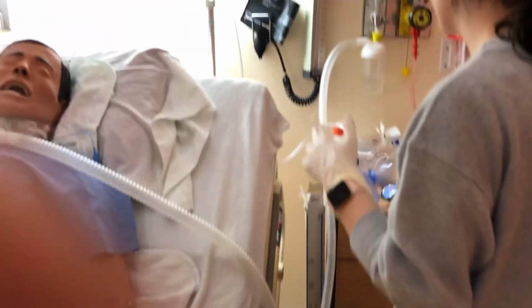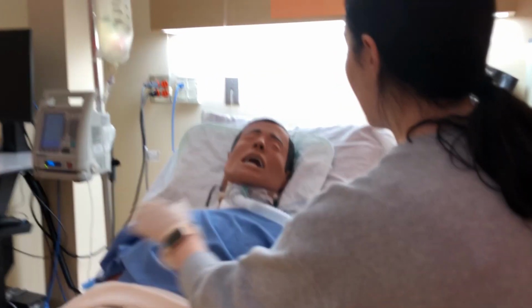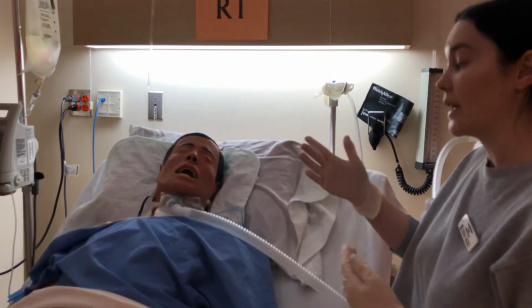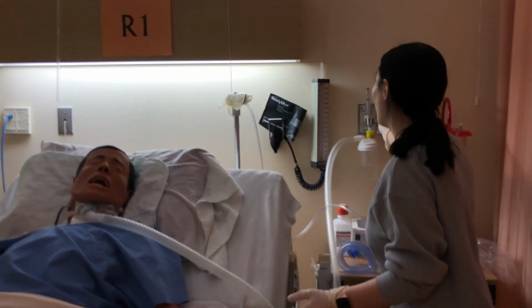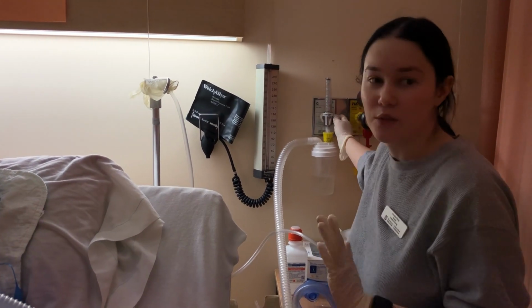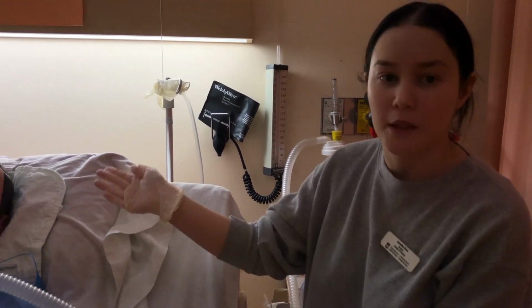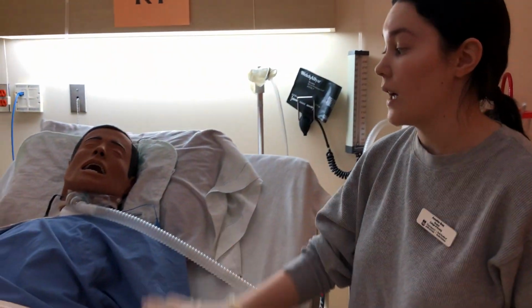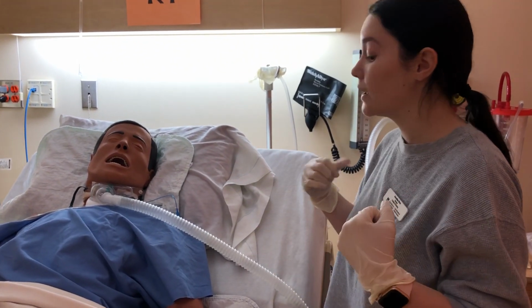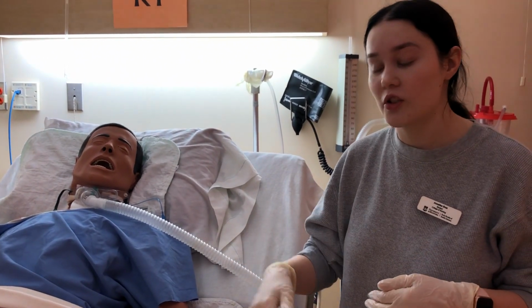All right. So I have to suction my patient. Prior to suctioning, my patient is able to take breaths on their own. I put the oxygen up all the way, just so that you can hear me. I'm going to turn the oxygen off, but it would be on. My patient would have an OSAT monitor on, and I would instruct my patient, can you take 2 to 3 deep breaths for me? We're going to watch their oxygen go up to 100%.